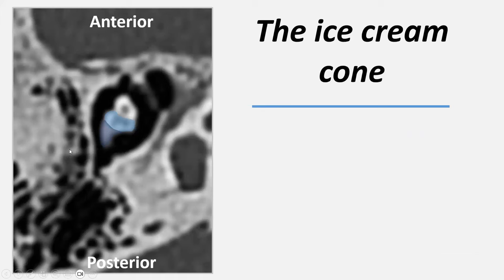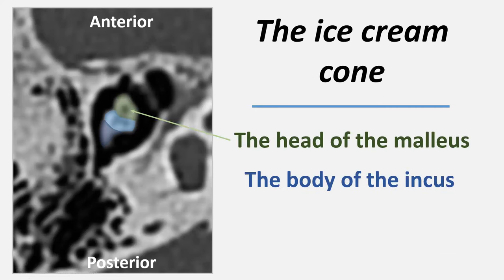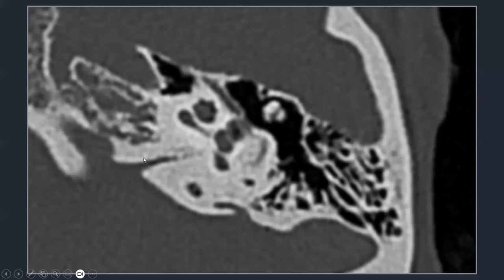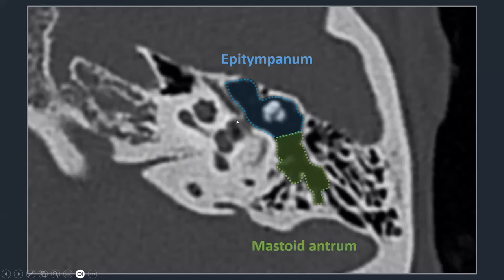On magnified images, we can clearly see the head of the malleus, the body of the incus underneath, and the short process of the incus pointing posteriorly in a triangular shape. The aditus ad antrum is the opening between the epitympanum and the first and largest mastoid air cell — the antrum — which communicates directly with the epitympanum.